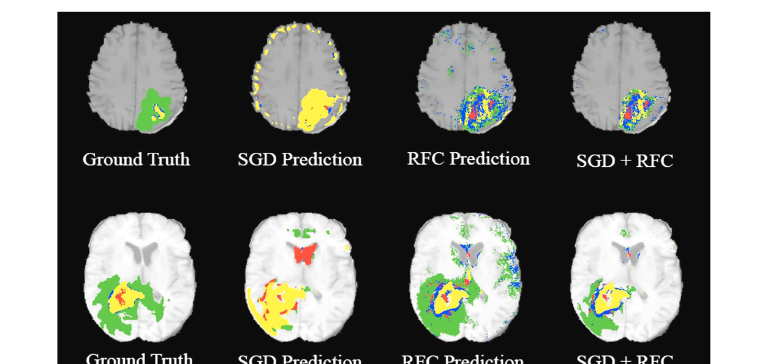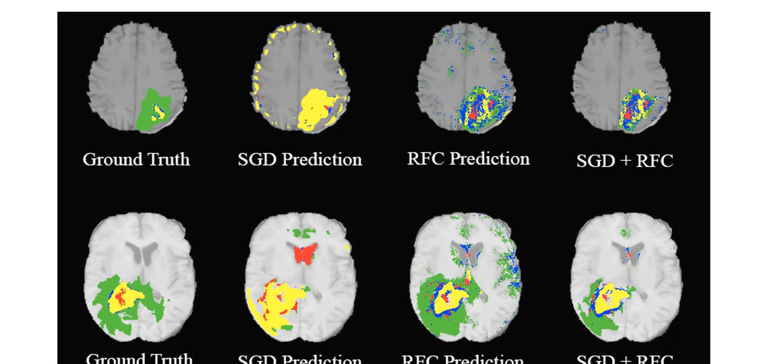But this was all circumstantial because we used 1 lakh patches to train our model, and for different kinds of data we got different accuracy. So the overall accuracy of the project was never found because we didn't have enough computational power to calculate it or to train it on more patches. We tried using 50,000 patches, that is 10,000 for each of the classes, and we tried predicting with it, but it didn't show promising results. So we increased our patches to 1 lakh patches, and then we tried doing the same, and we got this much accuracy. We were hoping to increase our number of patches, but we didn't have enough computational power.